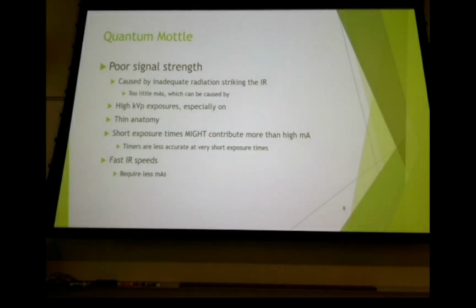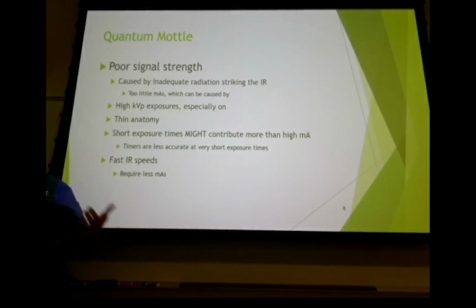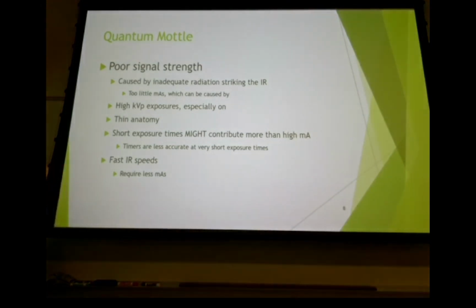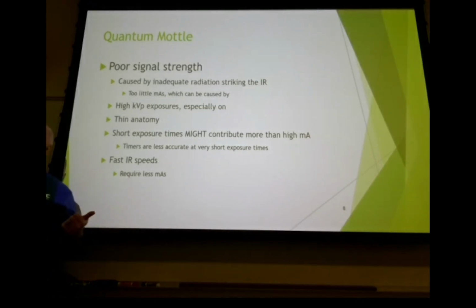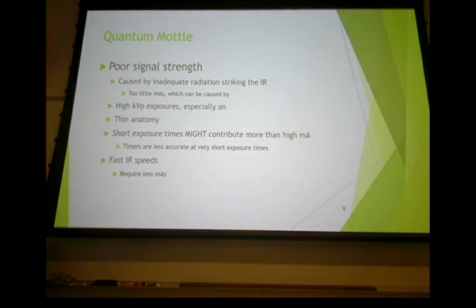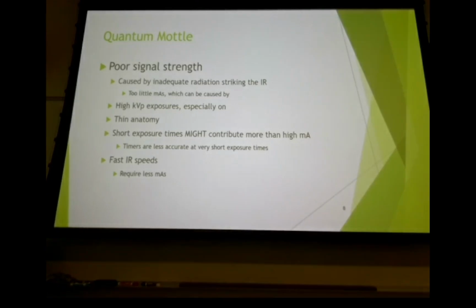And I was trying to make the point, before you open the door, make sure you knock, because if that film bin is open and somebody walks in, then that entire film bin is exposed to white light, and it all turns black, okay? More on that here in a minute. But I was trying to make the point, knock on the door. So I took film out of the film bin, put it on top of the countertop, and turned to the students. I had like 4 students in there. I said, flip the lights as fast as you can.